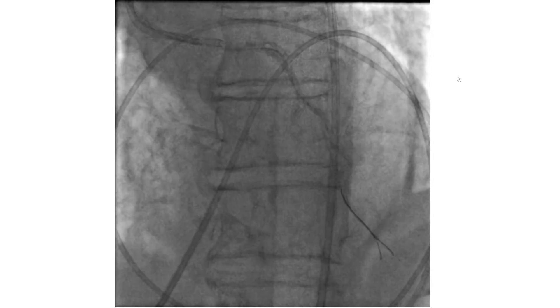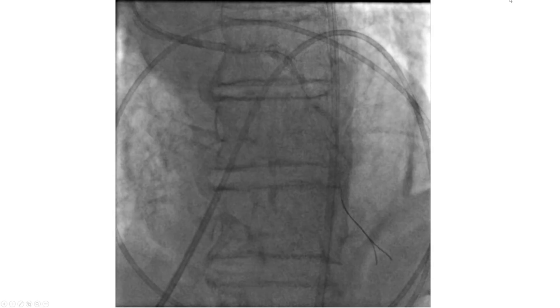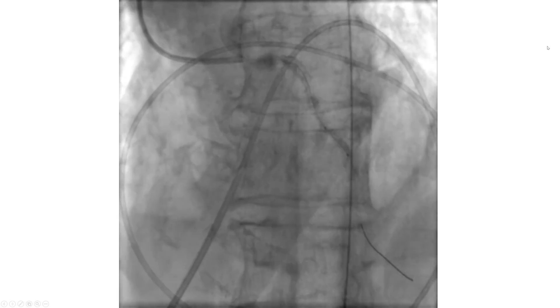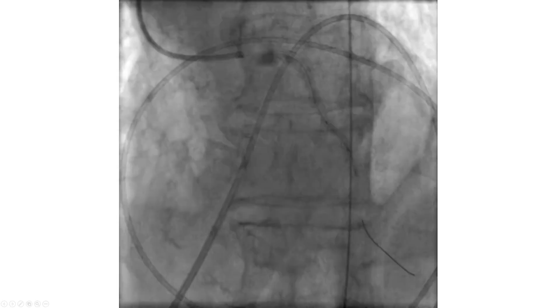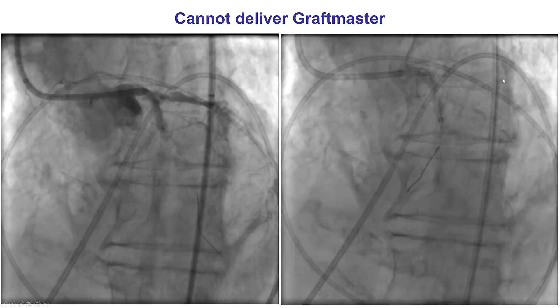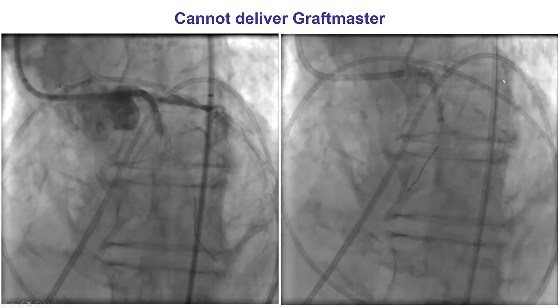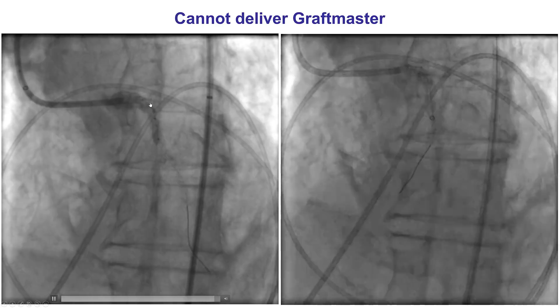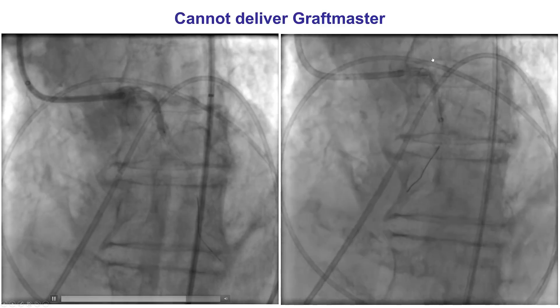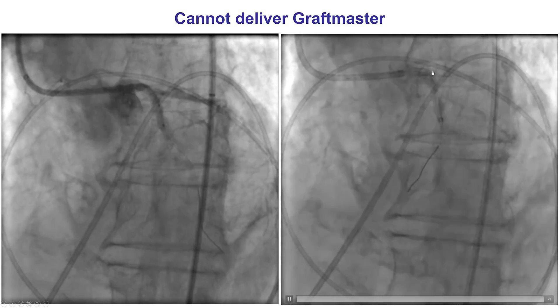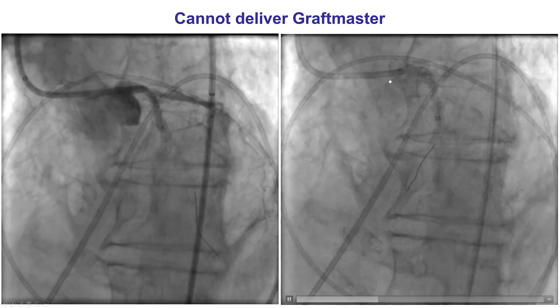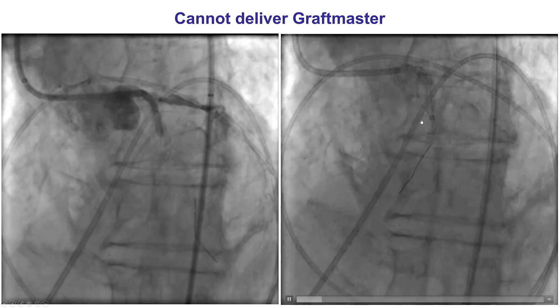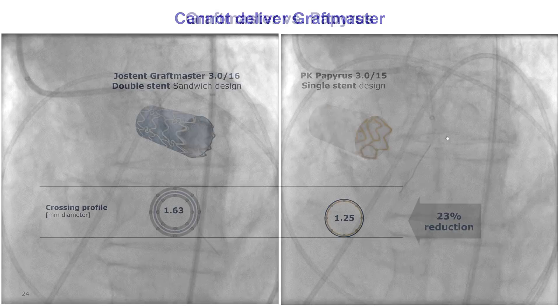Treatment for a large vessel perforation is a covered stent. The challenge here was a major diagonal branch that we couldn't wire despite multiple attempts. Eventually we advanced a guidewire into the diagonal branch; however, despite balloon inflations we were not able to deliver a GraftMaster. There was severe calcification. We transiently lost and then regained wire position in the LAD. We switched from radial to femoral, using an 8 French guide and 8 French GuideLiner, but despite this setup we still could not deliver the covered stent all the way to the perforation site.